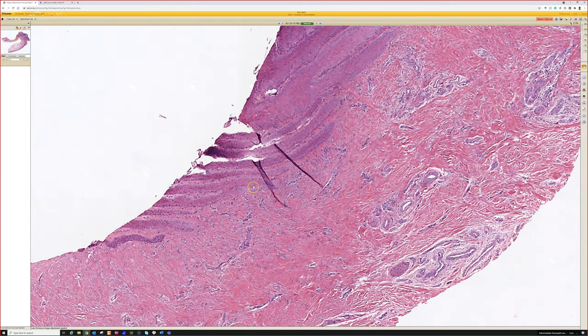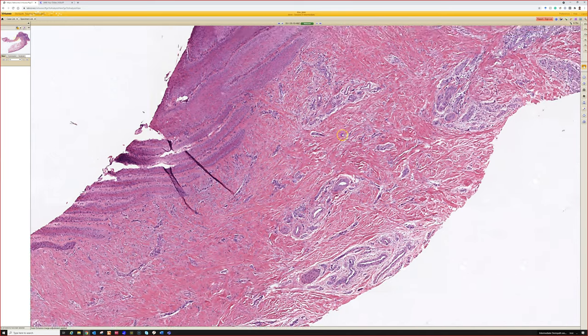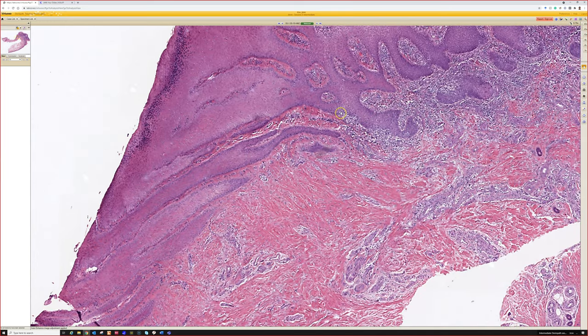But what I did want to point out is that unlike in regular skin where the rete have kind of the little test tube shape, in the nail bed epithelium, they have these very jagged kind of bases. So if you see something that looks like epithelium, like skin surface or epidermis, but has very jagged rete, you should think about, oh, maybe we're underneath the nail. Like if it's a quiz and no one's told you where it's from, something like that. So this is not perfect because it's a very distorted angle.